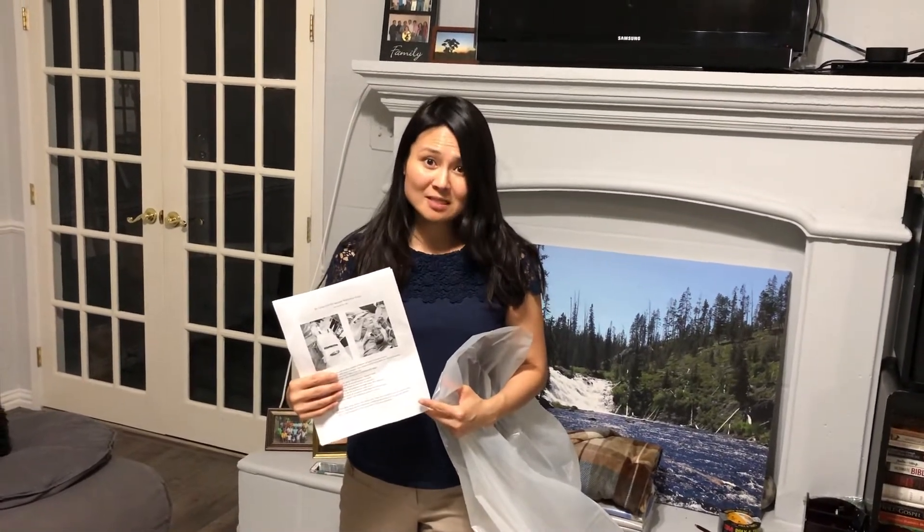Hi, I'm Dr. Crystal Lang. I'm an internal medicine hospitalist in Dallas, Texas, and I'm going to demonstrate how to use the St. Louis COVID aerosol reduction cover.